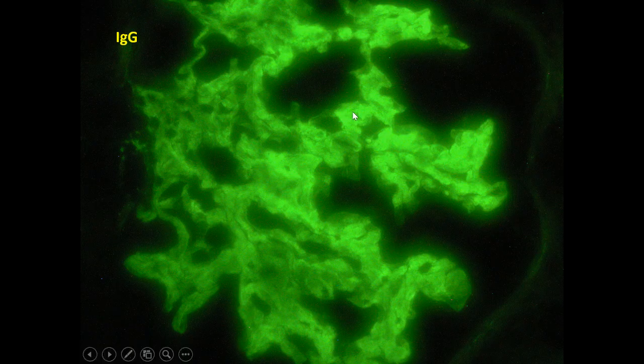It's not granular, it's not linear. It is defined as smudged, and it is mainly in the mesangium, as you can see here, and also some portion of the capillary loops are also staining positive.